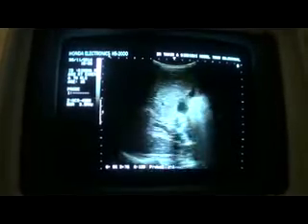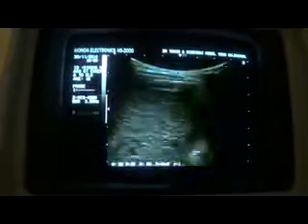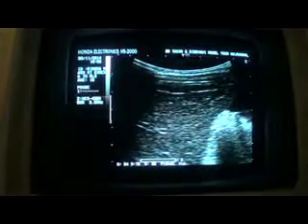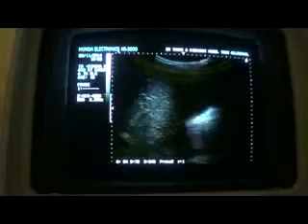This is the liver. Now first to see is that the outer surface of the liver is smooth. The echogenicity of the liver is normal but appears to be raised because of the fluid surrounding its posterior surface. This is the fluid surrounding the anterior surface. This is the anterior surface of the liver. This is the liver. Okay. Next.